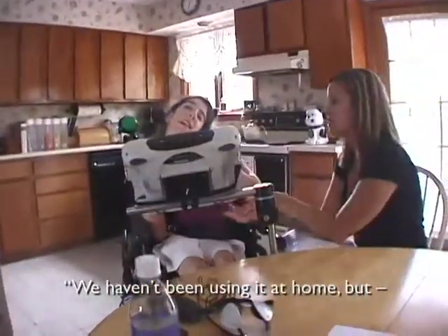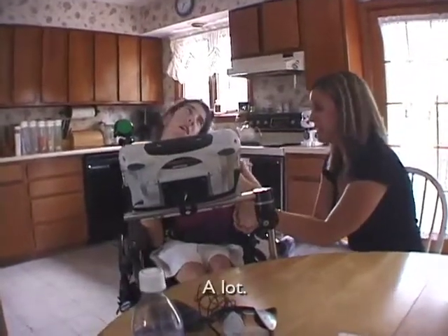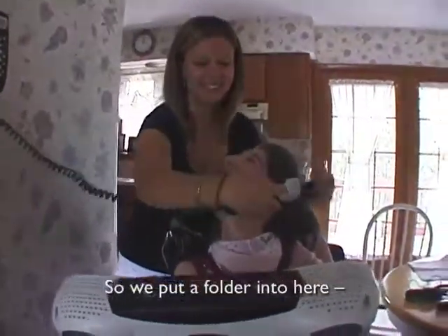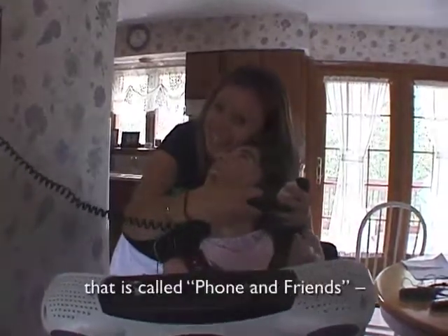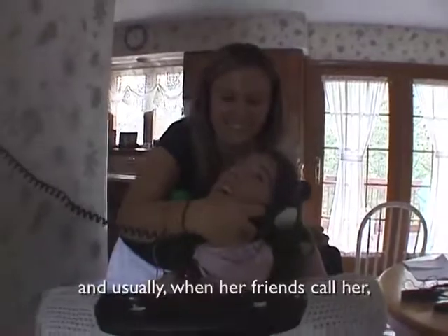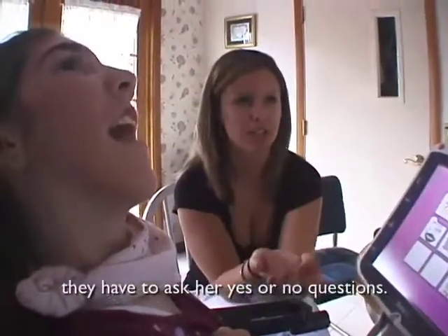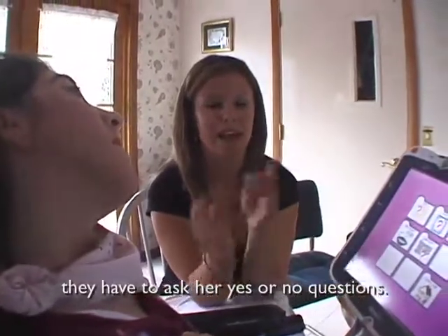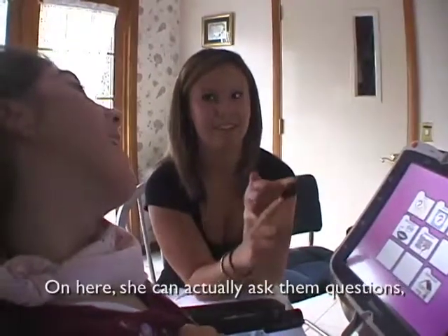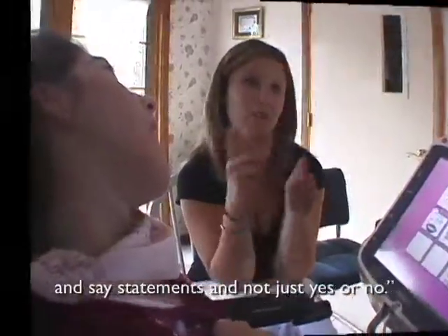We haven't been using it at home, but she likes to talk on the phone a lot. So we put a folder into here that is called Phone and Friends, and when her friends call her, when I call her, or when anyone calls her, they have to ask her yes or no questions. On here, she can actually ask them questions and say statements and not just yes or no.